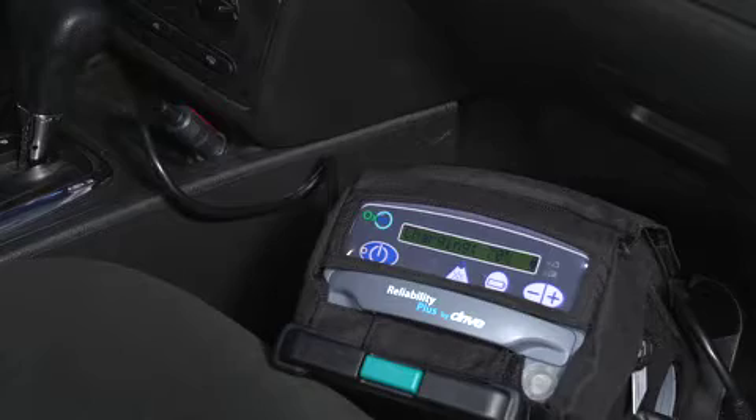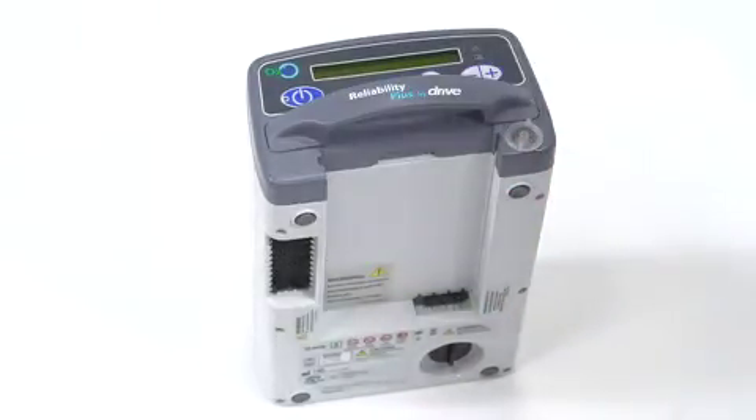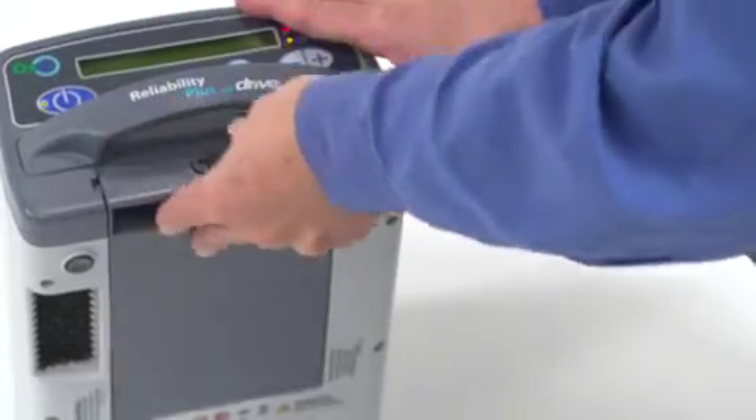In addition, it comes fully equipped to use, charge, and transport. The Oxus comes with an easily accessible external battery that will last an impressive four hours at the most commonly used liter flow setting. With this external battery, you have the freedom to bring additional batteries on longer trips and simply replace it as needed.